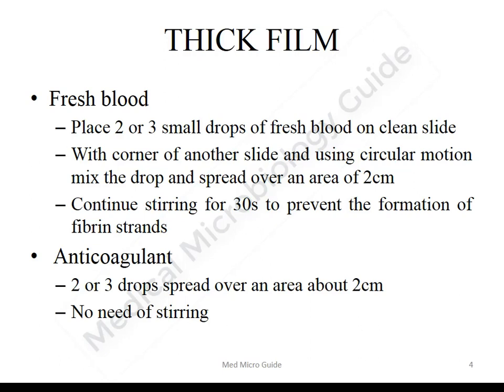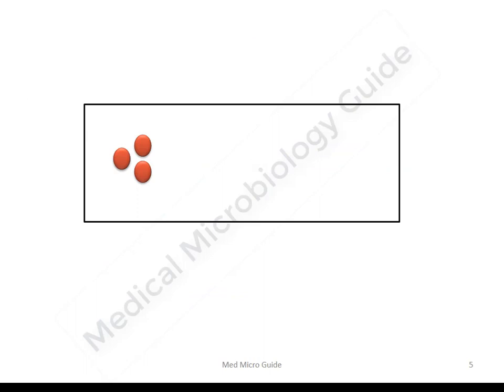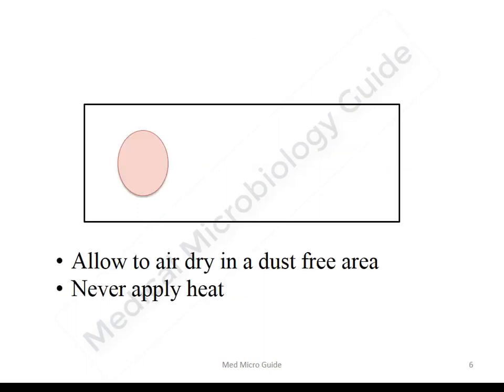If using anticoagulated blood, take two to three drops of blood and spread it over an area of two centimeters. There is no need for stirring as there is no formation of fibrin strands in anticoagulated blood. Allow the thick smear to air dry in a dust-free area and never apply heat. Applying heat will stick the smear onto the slide and it will not be de-hemoglobinized when placed into distilled water or buffer solution.